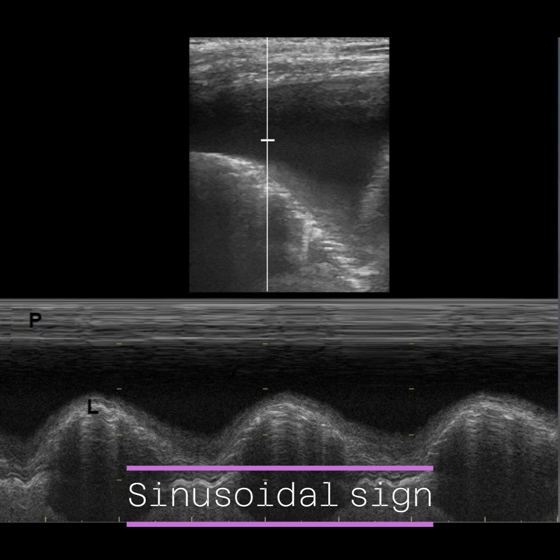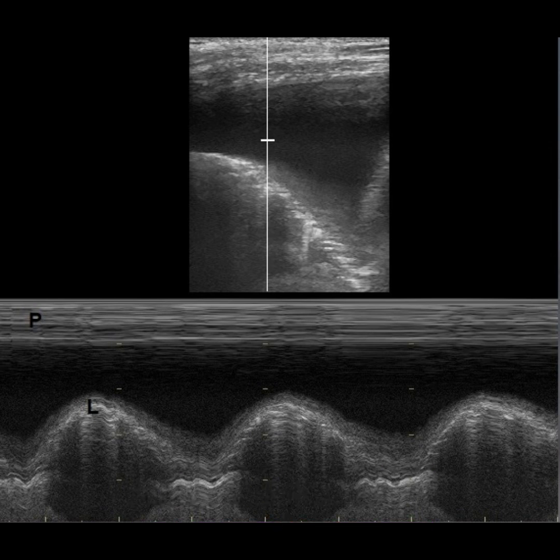Here, with the motion of that visceral pleural edge moving within the pleural fluid, we can see a sine wave pattern, which produces this graphical display on the M mode. And this highlights to us that it is in fact fluid within that region. It's the inward and outward motion of that lung tissue within the anechoic effusion. I've found that helpful one or two times in the past, and maybe that's something you can use if you're uncertain about what's going on.